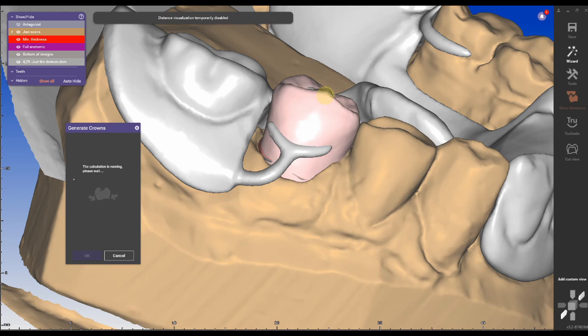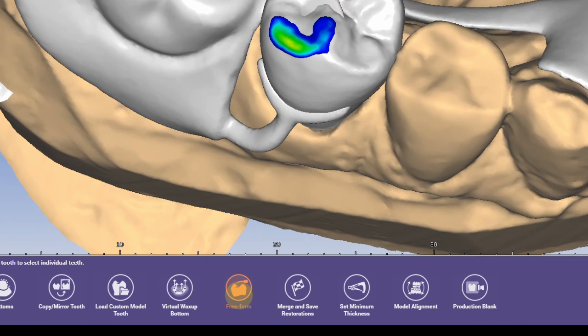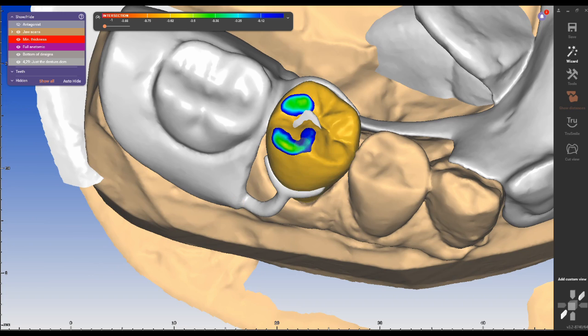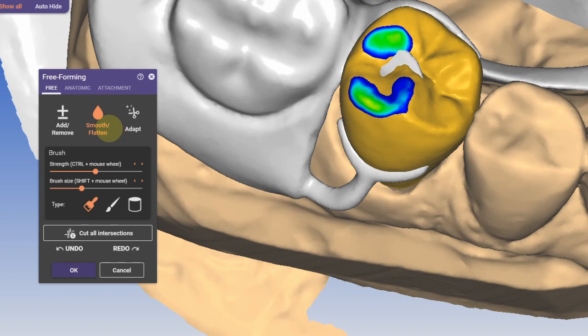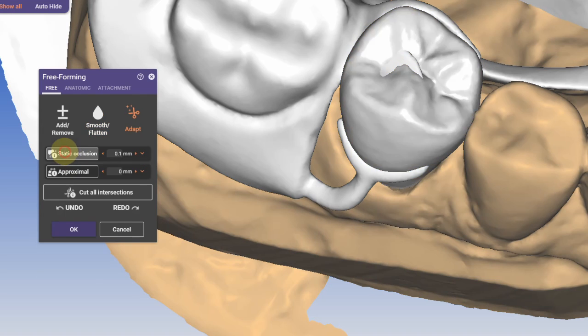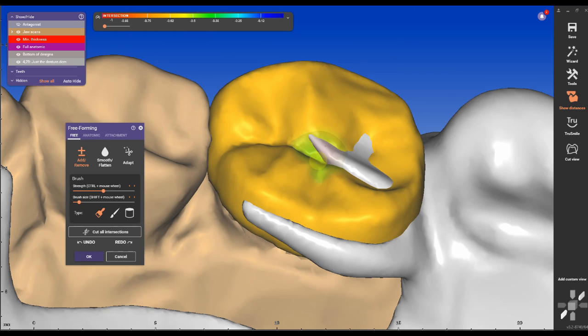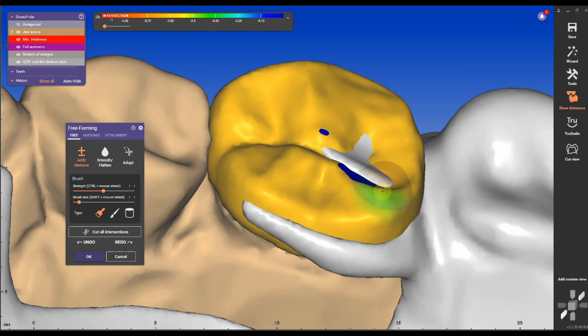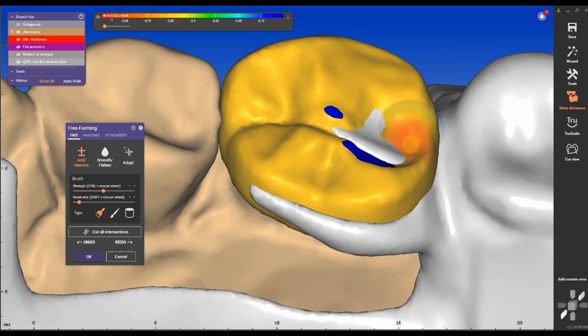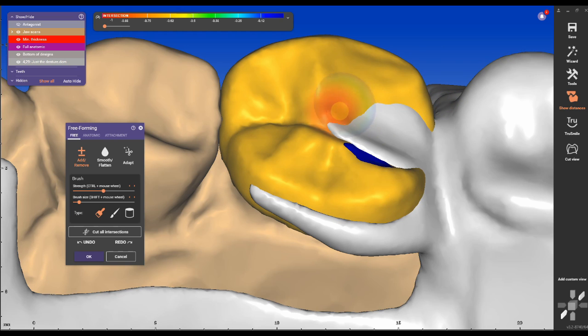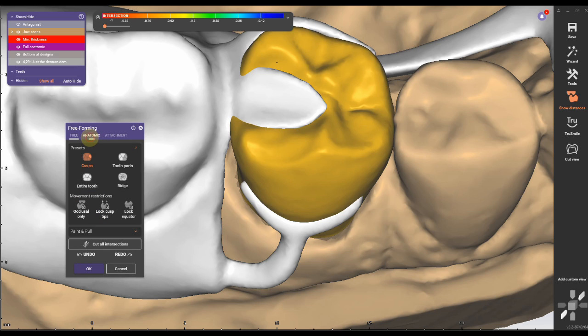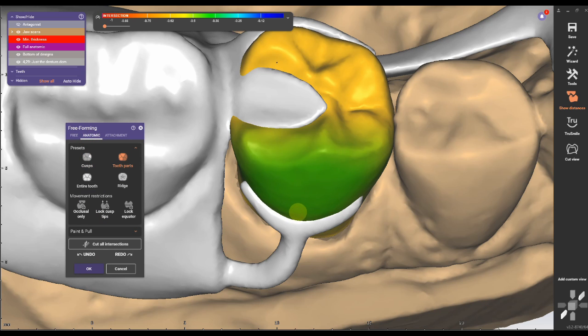Now under freeform I'm getting rid of the high occlusal spots by adapting the static occlusion. I'm also adapting the approximate contacts under proximal and making sure that the occlusal rest of the partial is fully embedded into the crown. With the add and remove tool and holding shift, I'm cleaning up the areas where the crown is overlapping the occlusal rest. Under anatomic and tooth parts I'm reducing the space between crown and facial clasp.